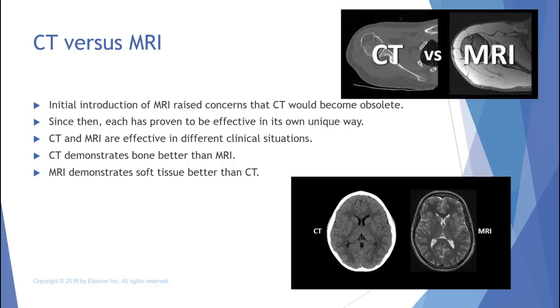Okay, CT versus MRI. Look at that. The initial introduction of MRI raised concerns that CT would become obsolete, and now we know that that is not the case, and it's never going to happen. CT is much too valuable a tool. It takes images very quickly.